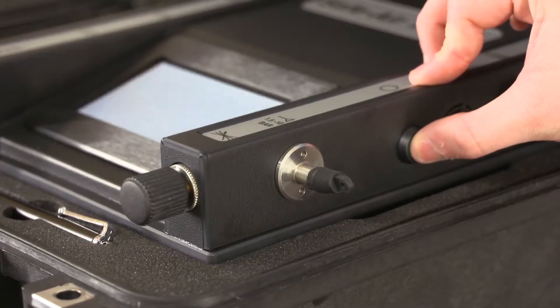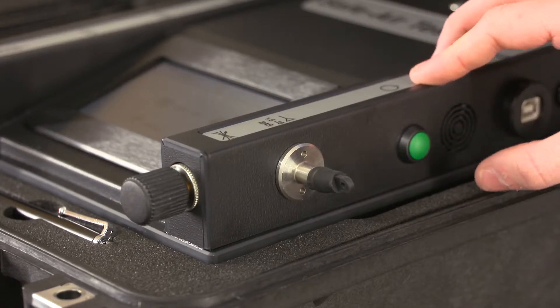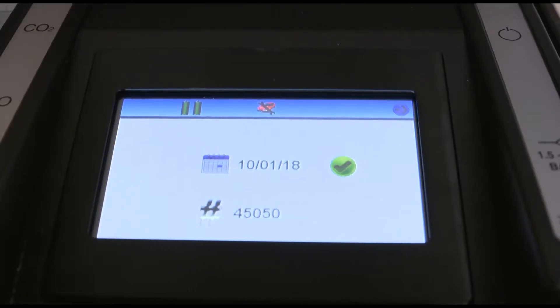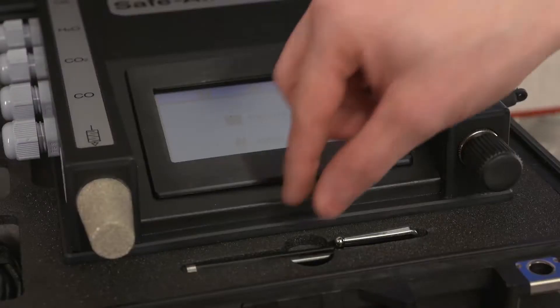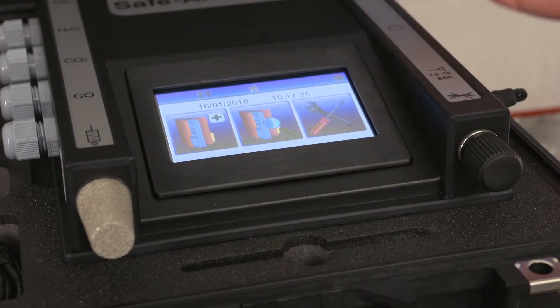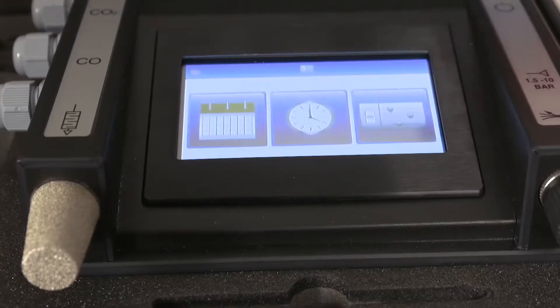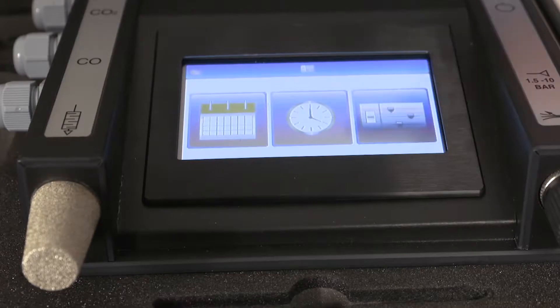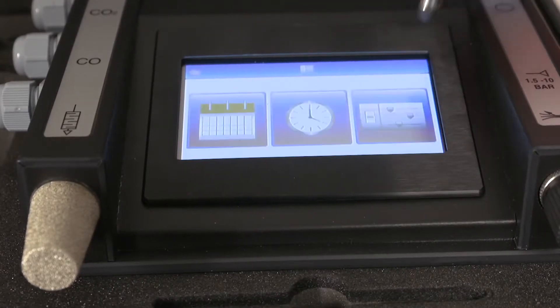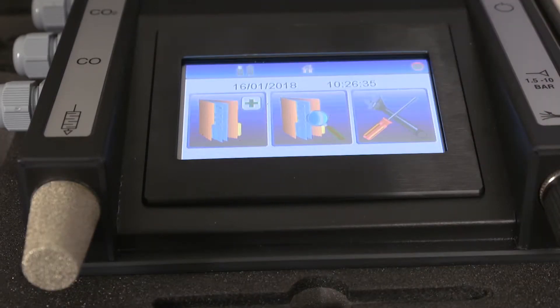To carry out a test, first switch on the machine by pressing and holding the on button, which is on the right hand side of the unit, for approximately 3 seconds. The display will show the model, then the serial number, date last calibrated, and whether it's within the recommended calibration period. Press the arrow key to progress to the main menu where the current date and time will be displayed. To change the default settings such as date, time, language and units of measure, enter the configure tester screen. To carry out a test, press the begin test button.